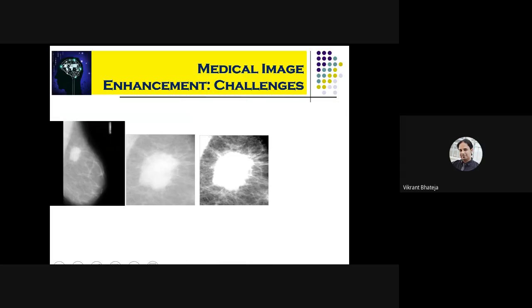You can see the same thing with an example. Suppose this is the original image, this is the original region of interest, and suppose we want to do excessive contrast improvement. What we see is that the overall brightness of this particular region has increased, right? So again, the contrast enhancement should be noise controlled.